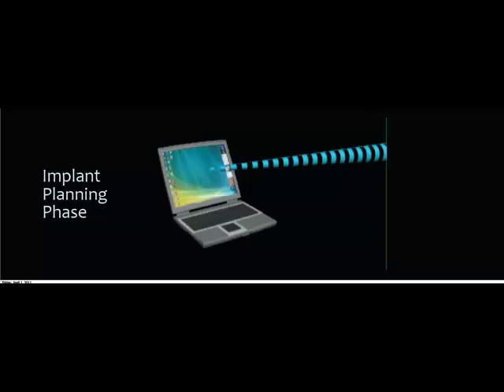Now we can plan and position our implants to match the position of these future teeth in the best prosthetic and aesthetic location. And we can plan it in a great fashion, where we can even design and put our virtual teeth in there if we want, and match it up to that radiographic setup.